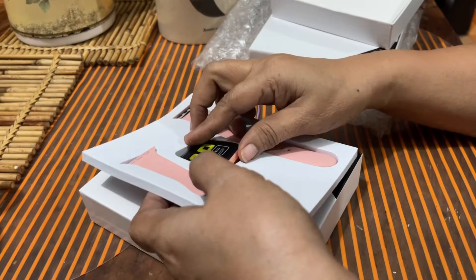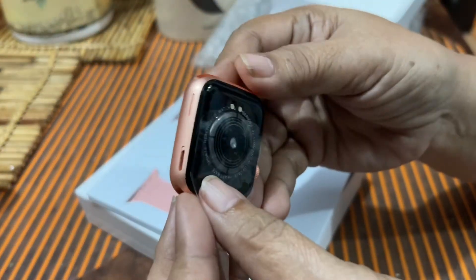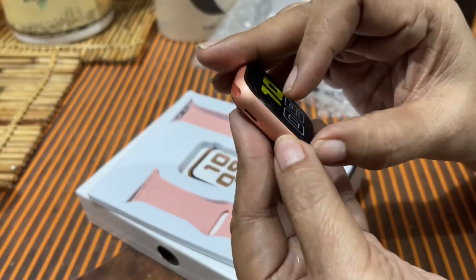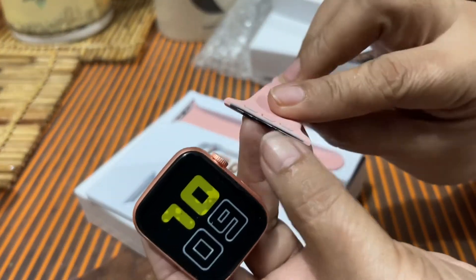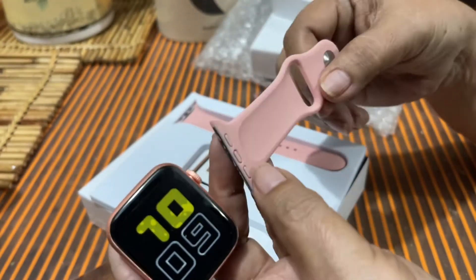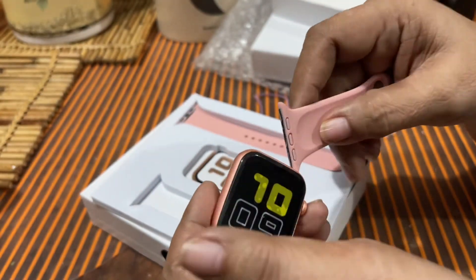Papakiramdaman natin ngayon itong item. It looks nice. Meron naman siyang plastic covering sa likod — yan yung charging part, and ito naman yung harapan niya. Nung hinawakan ko yung kanyang bracelet, it felt very comfortable. Pero parang feeling ko, madali lang itong masisira. Dapat sana naglagay sila ng extra.